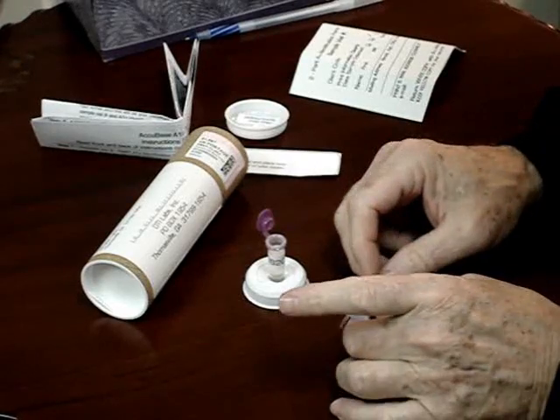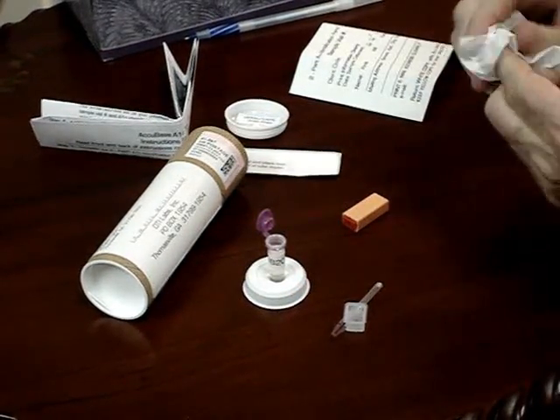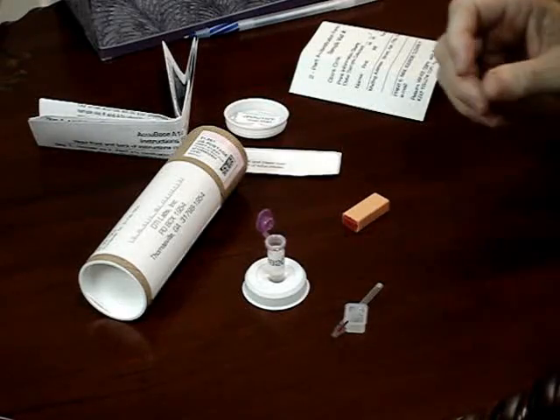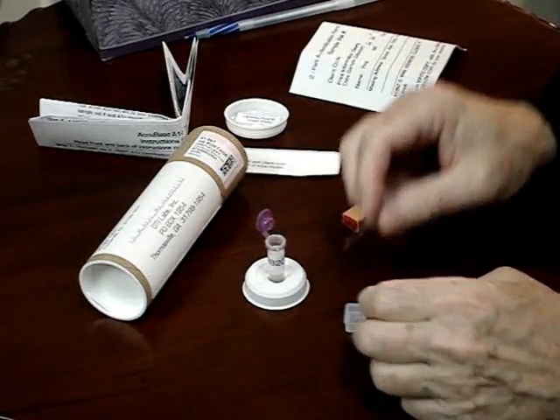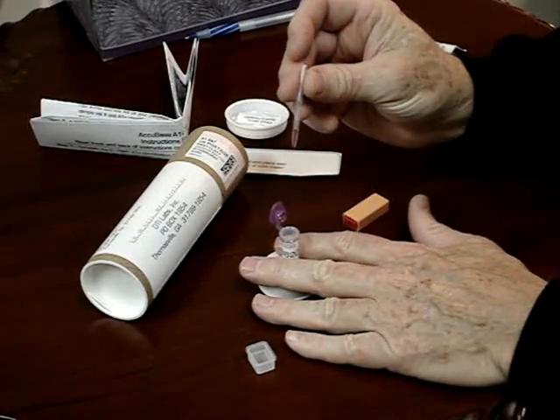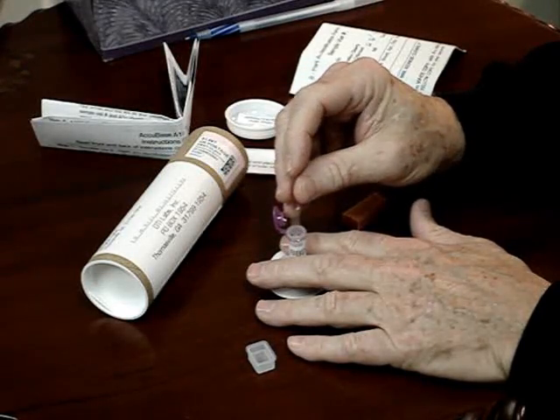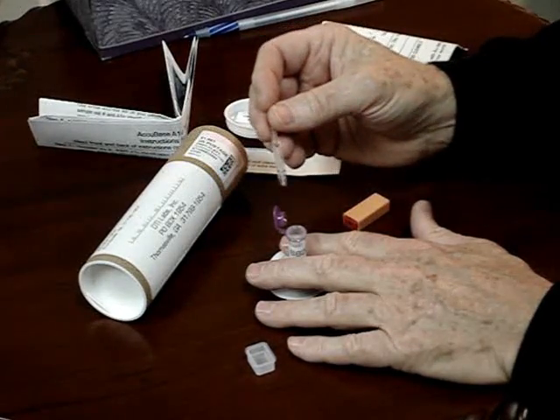Next, set your blood-filled capillary tube aside while you remove any excess blood from your finger. This will prevent you from getting blood on the lab forms and on the mailer. Now, while holding the vial with one hand, place the capillary tube containing the blood into the solution. Now squeeze and release pressure on the bulb portion to expel the blood into the reagent solution.